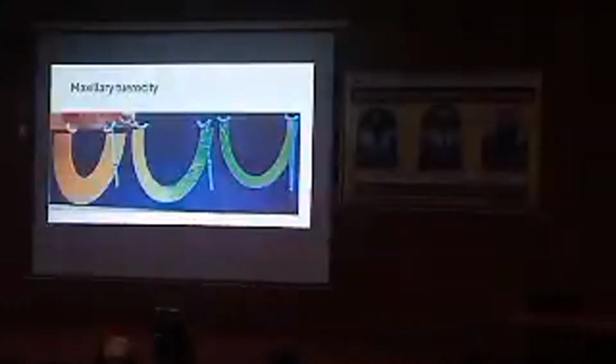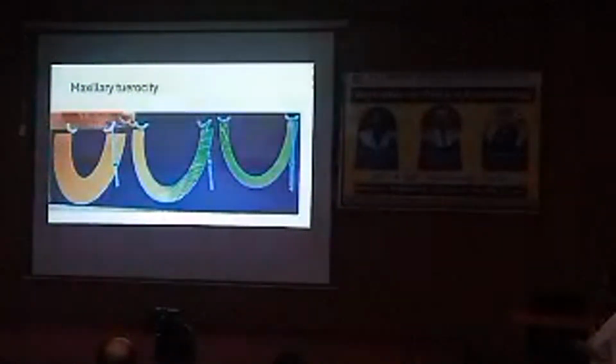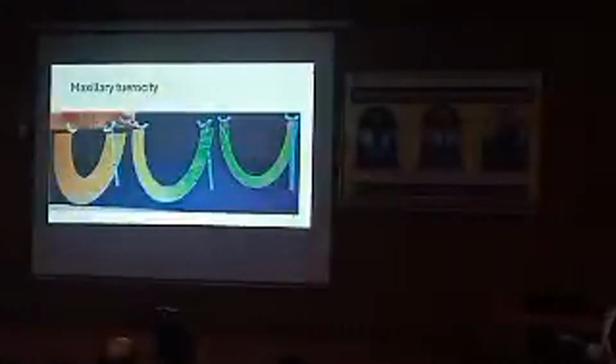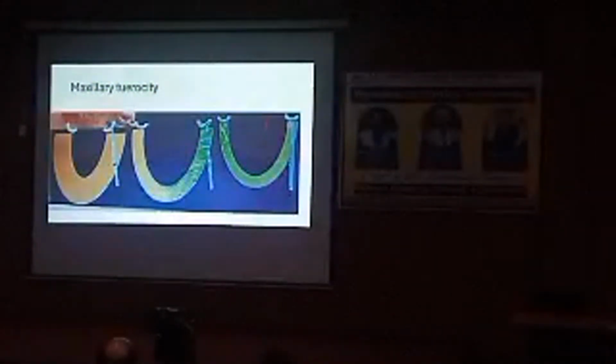So how maxillary tuberosity resorption helps you find the horizontal angle. In an unresorbed case, the pterygoids are more inwardly placed, so your angle with the hypothetical line will be more. Then, with resorption, your drill goes parallel. In very severely resorbed cases, where there is a class 3 relation in severely atrophic ridges, your drill almost goes parallel to the hypothetical line.